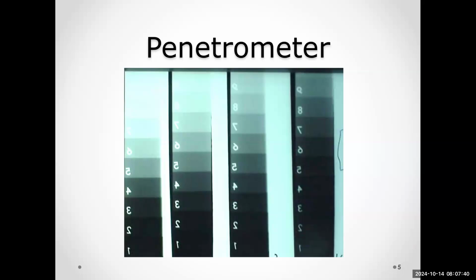Okay. So how do we know that the image on the right, and the image quality is not super great, but how do we know that the image on the right was done with a higher kVp? So it penetrated more. Yeah, so it's more uniform, right? The image on the left, at the top of that image, we can see that that area was not penetrated well at all, right?